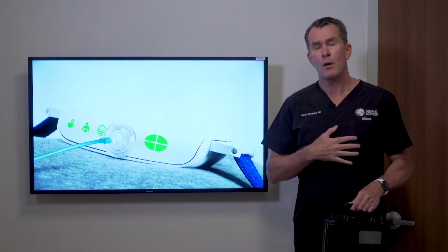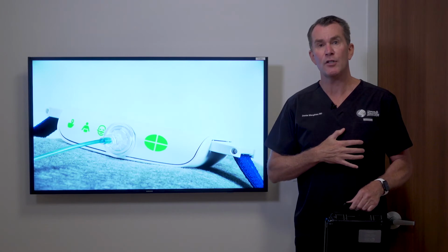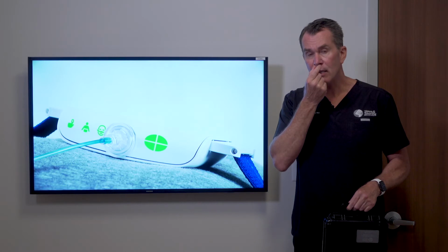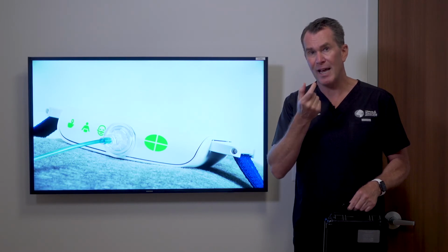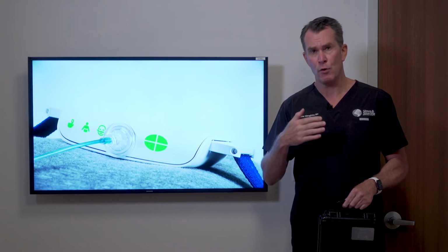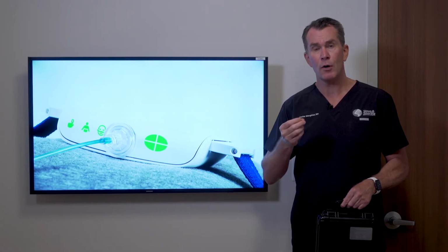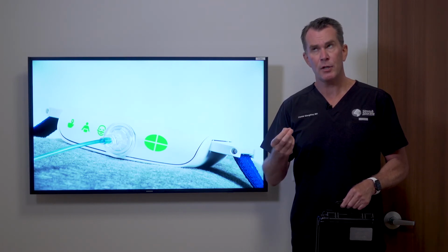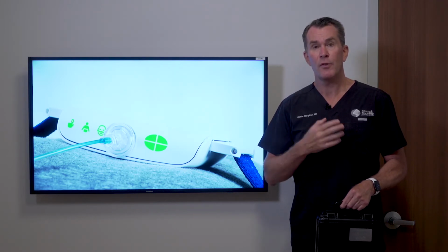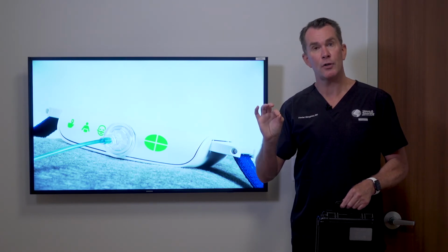What are we measuring? Well, the device itself, the belt, as you breathe in and out, it stretches the belt, so it measures respiratory effort. A small device that fits in the nostril that looks like a nasal cannula oxygen is a pressure transducer, which means it measures flow. There's a pulse oximeter on the finger. It's measuring the heart rate and the saturation. Essentially, an episode of apnea is when you're making respiratory effort, but there's a significant drop in flow with an associated drop in your oxygen saturation.